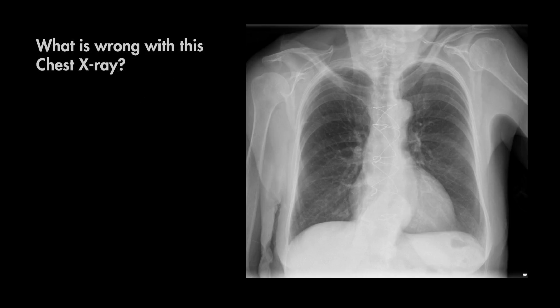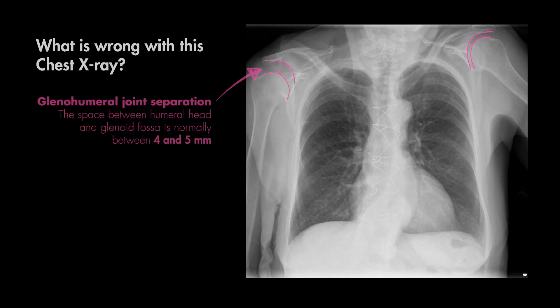Let's try this one — what do you see here? If you make note of the symmetry to the glenohumeral joints, you might notice that the right shoulder is dislocated. It might not be so obvious, but there is a separation of the right glenohumeral joint, which could be suggestive of a dislocation.